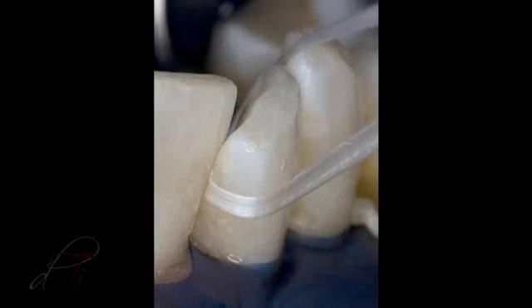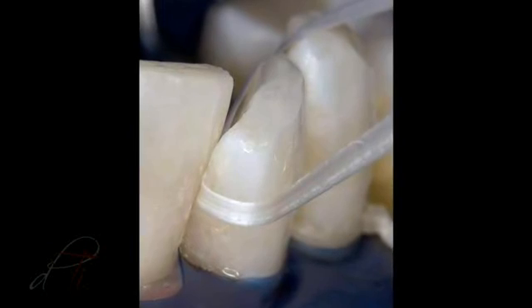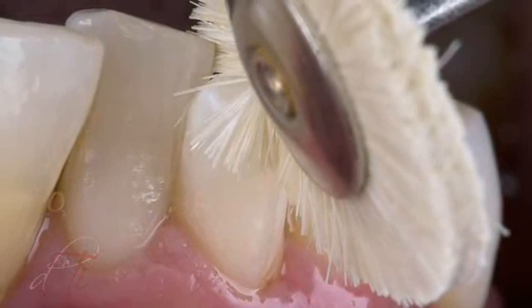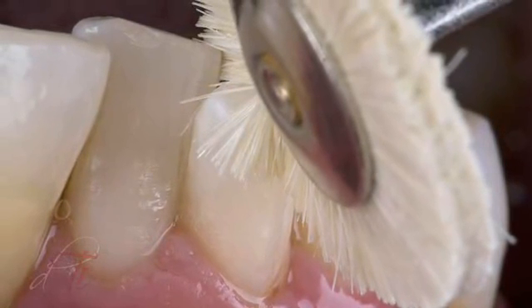The proximal surface was inspected for adequate contact with unwaxed floss prior to removing the dental dam. After the dental dam was removed, a definitive luster and surface reflectivity was accomplished with a goat-haired wheel and diamond polishing paste using an intermittent staccato motion.